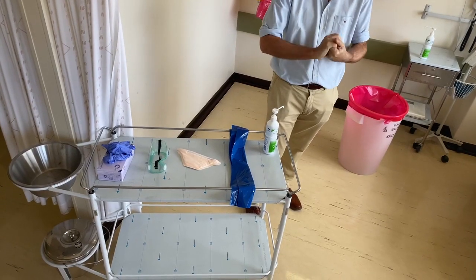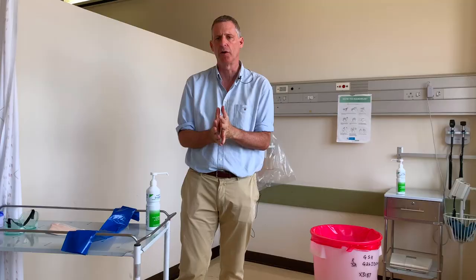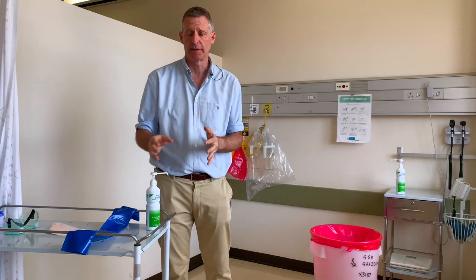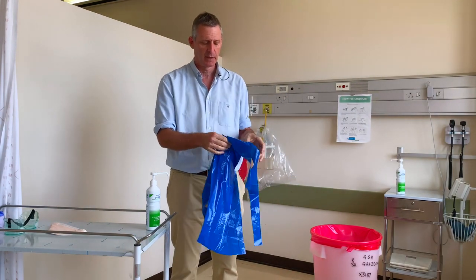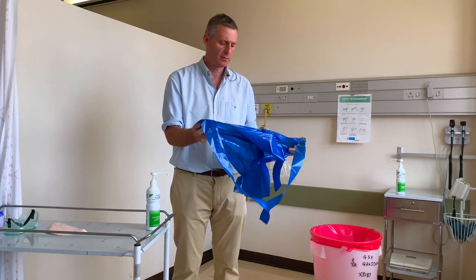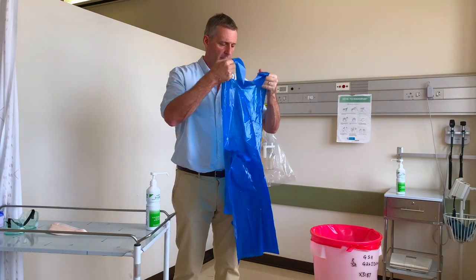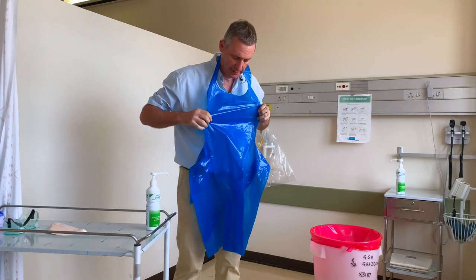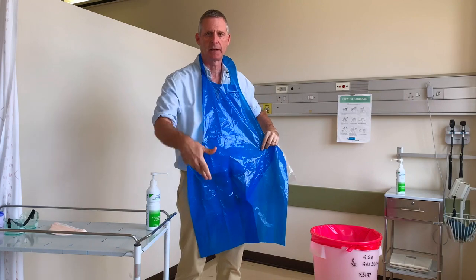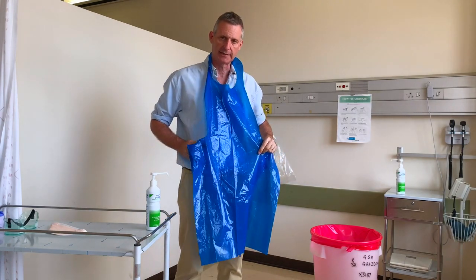The first piece of personal protective equipment I'm going to put on is an apron. You may be using a gown as well — that's fine. For this demonstration I'm going to use an apron and put it over my head. There will be a surface on the outside that can become contaminated, while the inner surface will remain uncontaminated.